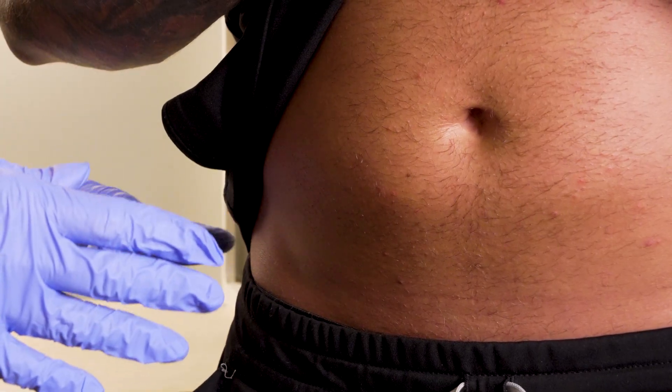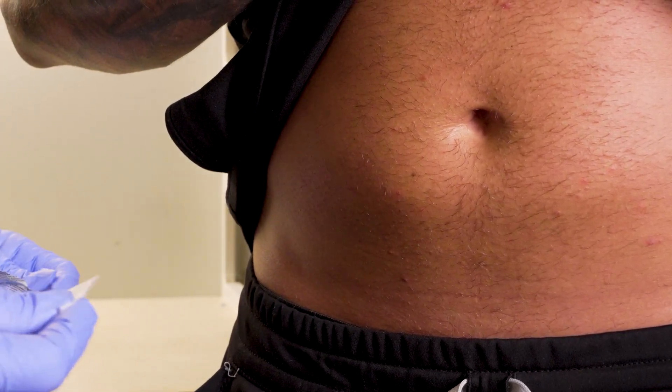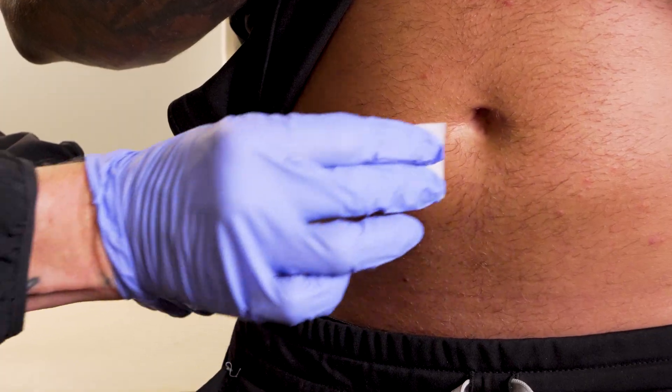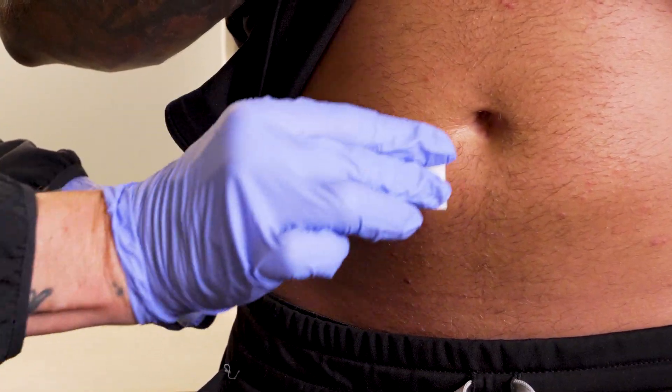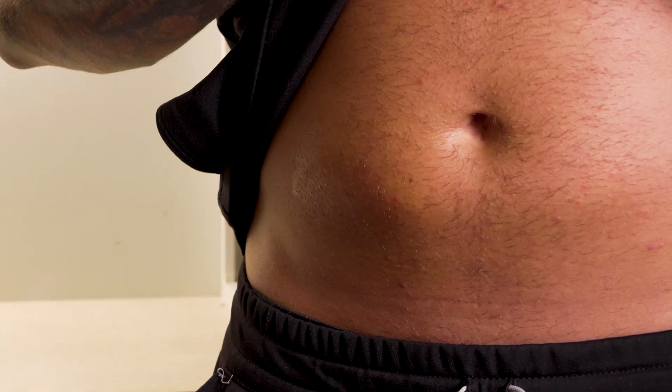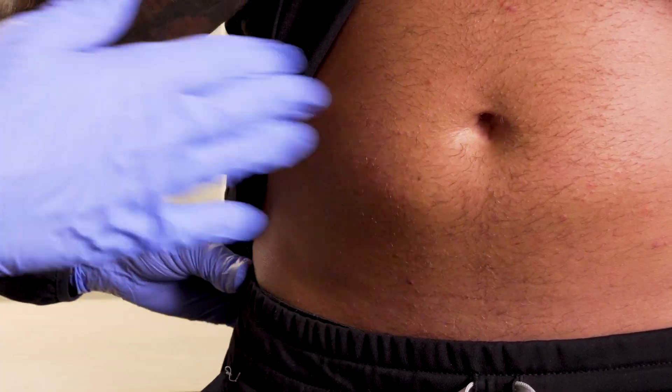So we're going to slowly push in the medication, then out and rub. We're also going to do a B12 subcutaneously. We're going to wipe the area, which is usually anywhere in the lower abdomen or upper thighs. Today we're going to use the lower abdomen. Go ahead and air dry it with your hand.